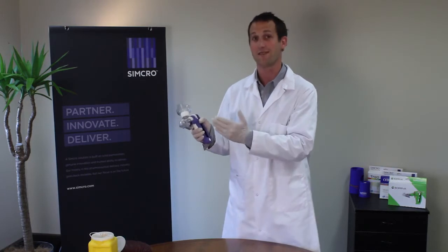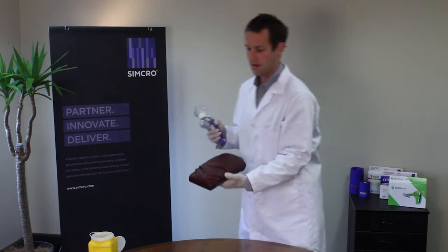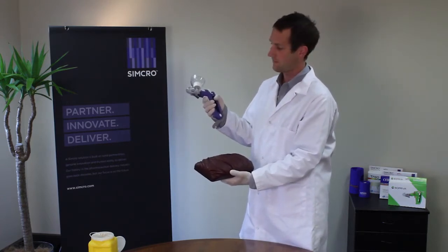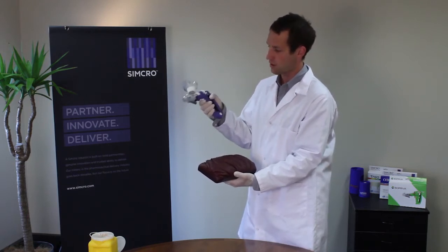We'll quickly demonstrate how it works because it does have a unique mode of action that you may not be used to. As we approach the animal to inject it, the first step is to pull the trigger — and you'll notice when you pull the trigger the handle can't close. So you pull the trigger so you've got a nice grip there.